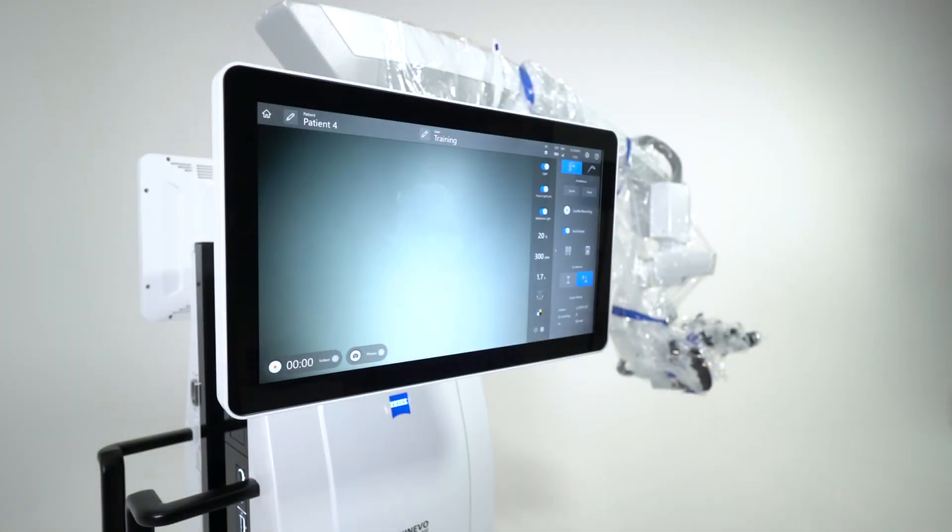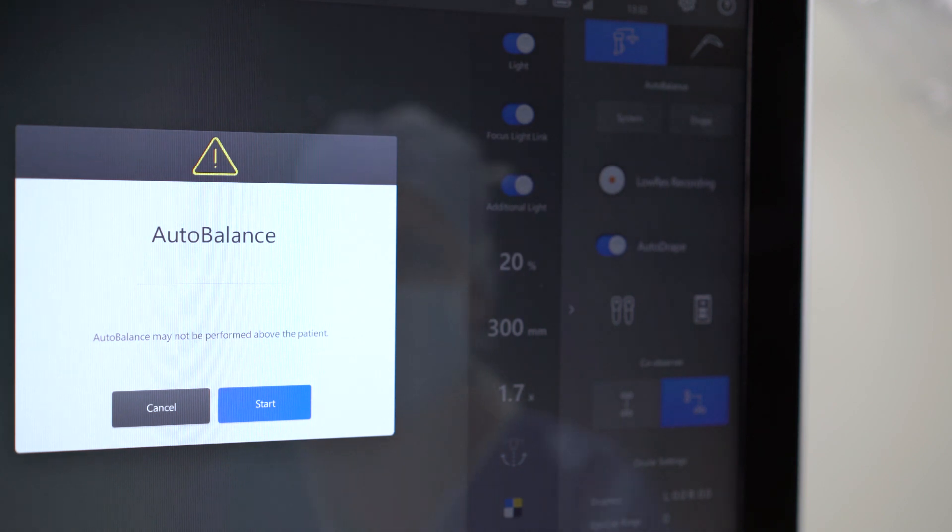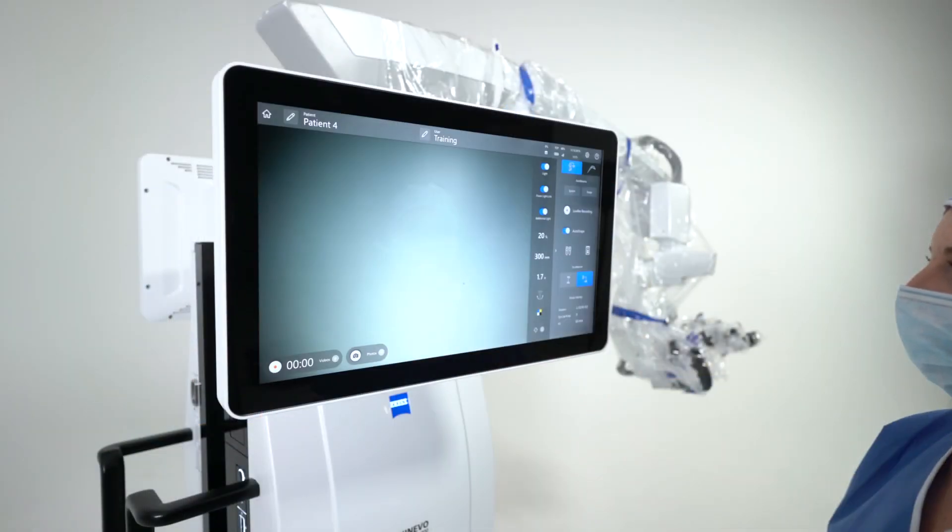After you completed draping the Zeiss Kenevo 900, make sure to start Auto Balance Drape. The balancing process will be done immediately. Afterwards, press Done to finalize draping Zeiss Kenevo 900 with Zeiss Smart Drape.